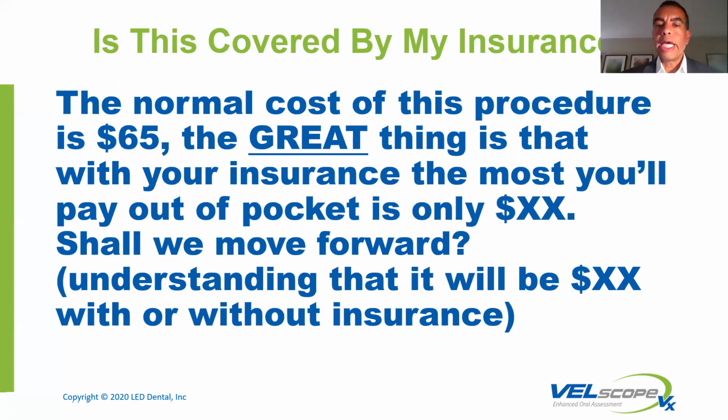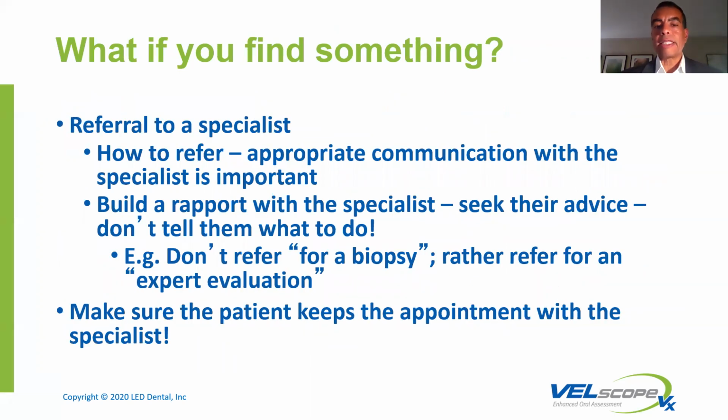Shall we move forward? And so what they found with this approach is, number one, if it's covered, it's covered, great. If it isn't, they're not spending time determining or finding out if it is covered or not. And at the end of the day, they've established the value associated with it, and you're also presenting it at a discount. You could definitely charge a lot more than 25 or 35, but you're providing a discount that hopefully the patients will appreciate.